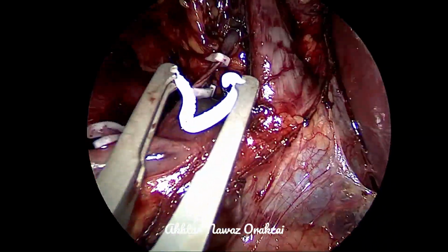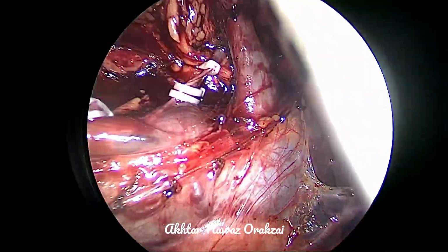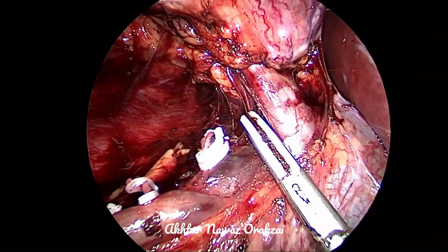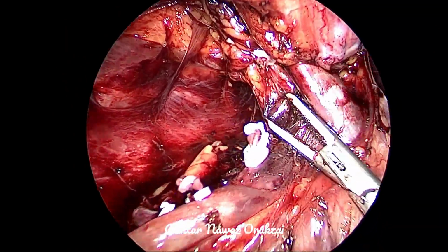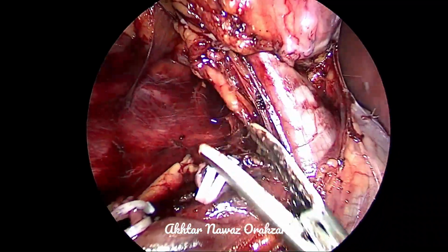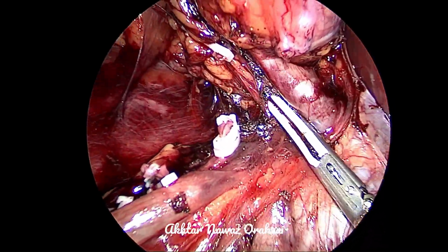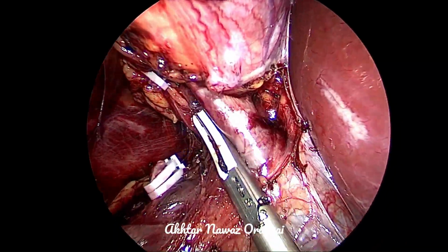The reason I'm not very happy about clipping the veins first is that at times the kidney becomes engorged, and the veins become so engorged that it's then difficult to apply clips around them. In that case, we may have to apply intracorporeal or extracorporeal knots before applying the clips, or you can use a staple device as well. That's why I'm not very happy about clipping the veins first, but here the situation is different.